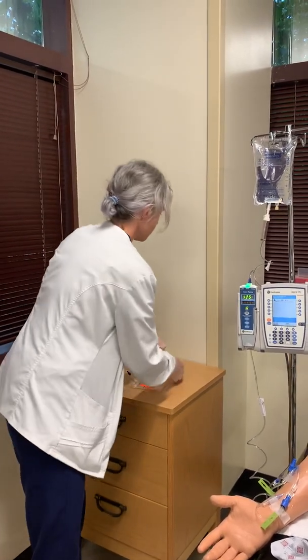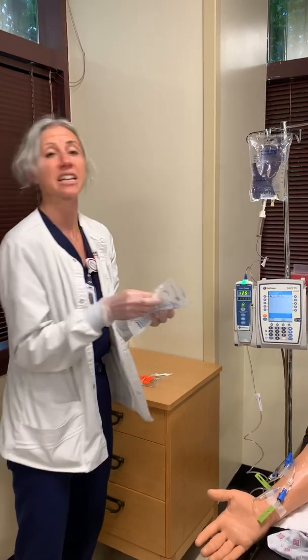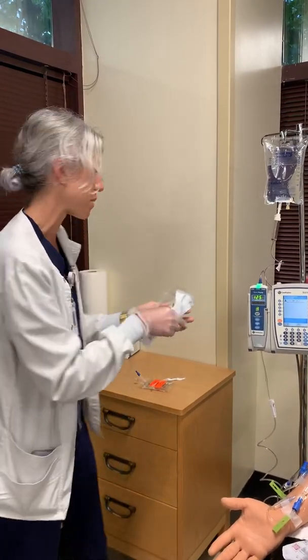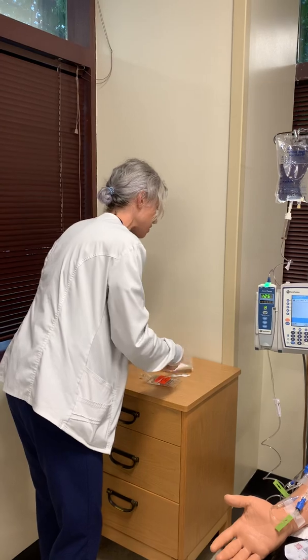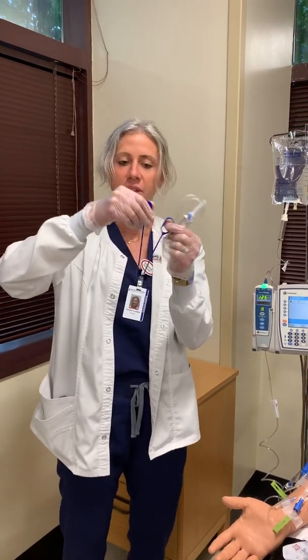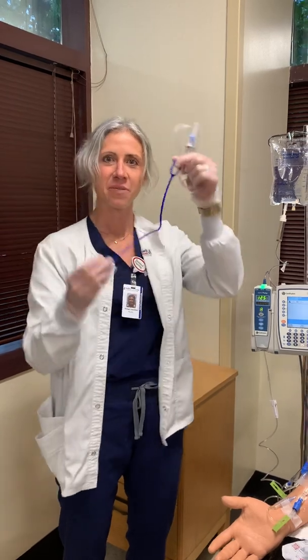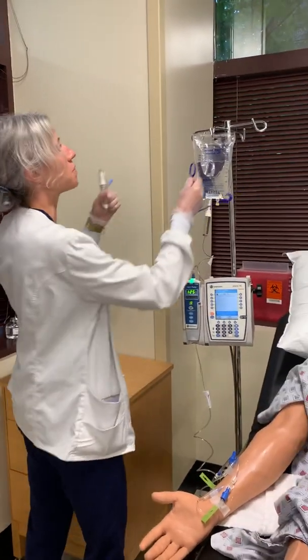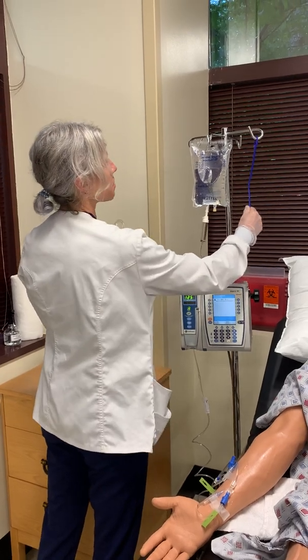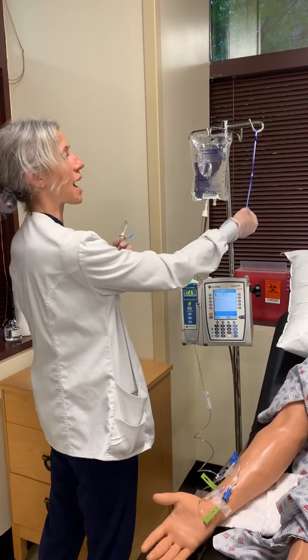There we go. Okay. And you're going to see, guys, that in the hospital, all of them are different. At UWE, we rip from the top, and these ones we're going to rip from the side, okay? So just make sure you're looking at all these things. The tubing does look very, very different. We've got this lovely thing right here. Y'all see that? So we're going to be hanging this on our pump, okay? This is very, very important, and you're going to see that people still forget to do this, even though it's in the bag, okay?